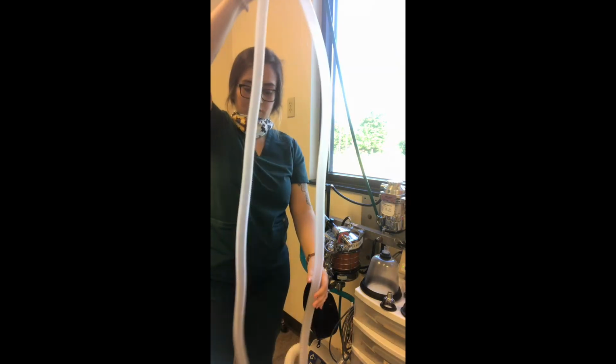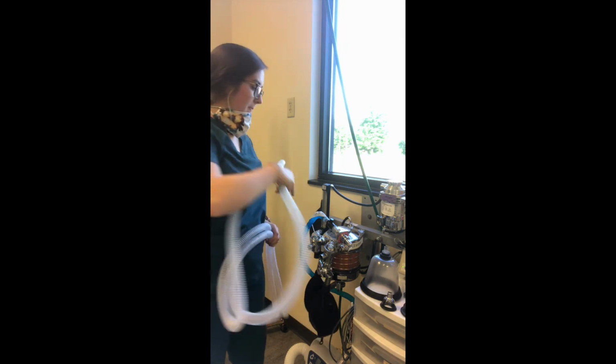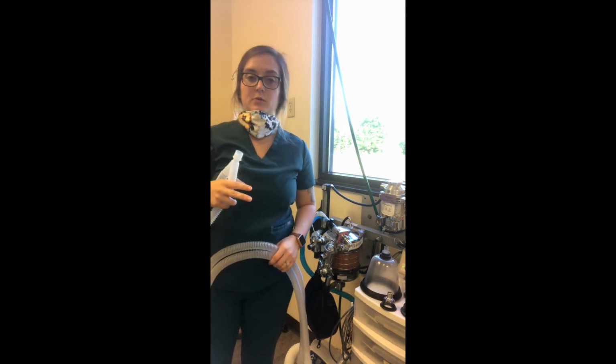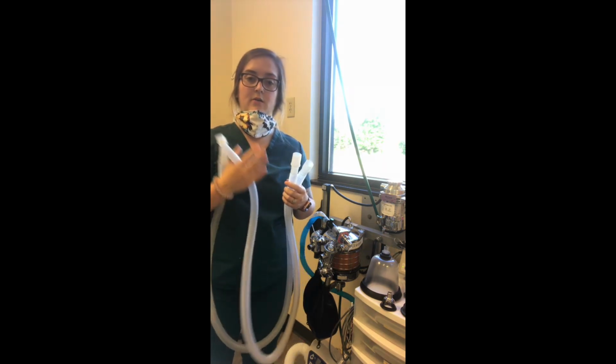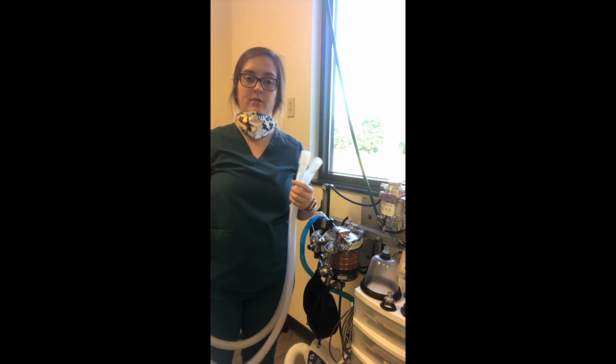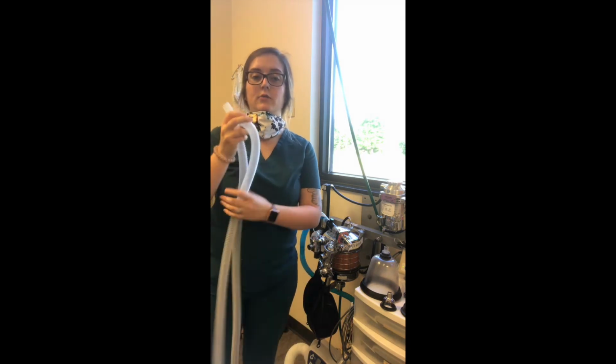The next system is a rebreather. So once this is hooked up, the patient does most of the breathing work for them. A portion of what they breathe out, they also breathe in the next breath. So we save this for our larger patients that are usually over 15 pounds.